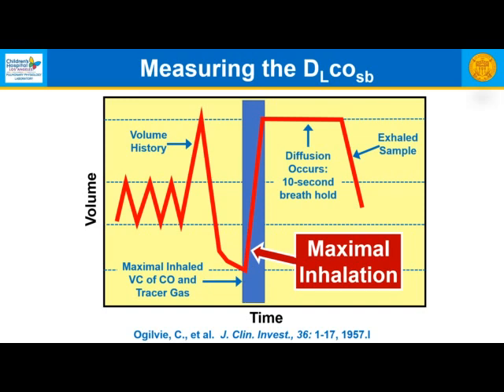So the important thing is that this is a maximal inhalation, all right? So you're going to inhale as rapidly as you can. This is going to become important in a few minutes. 10-second breath hold, exhalation, and then small sample collected fairly early.